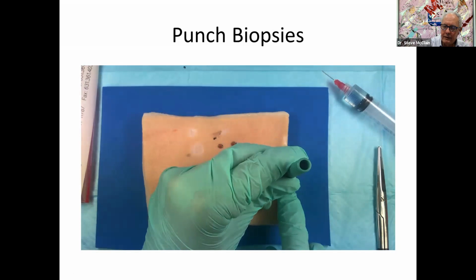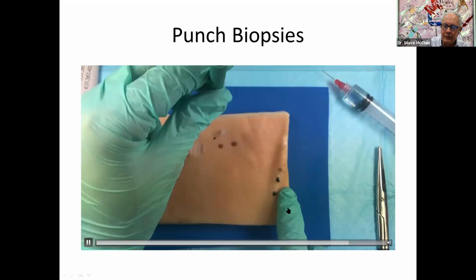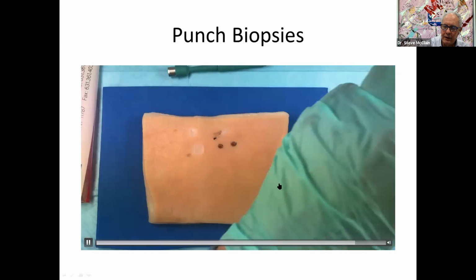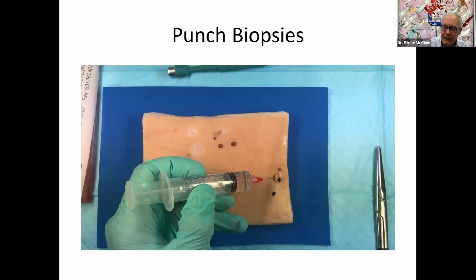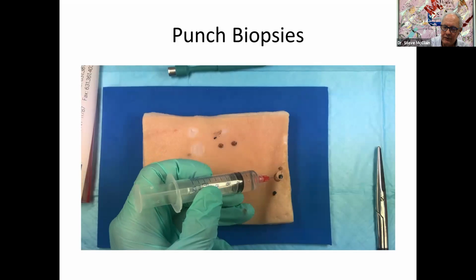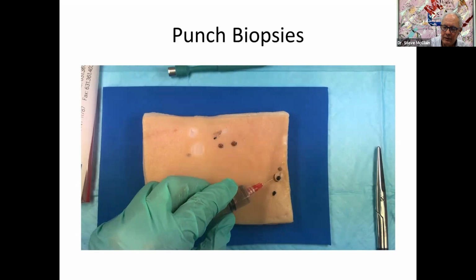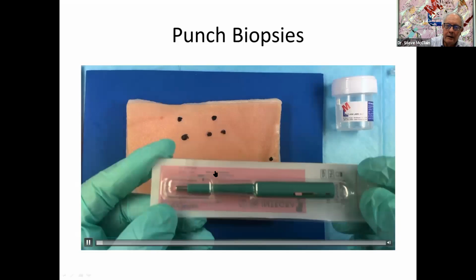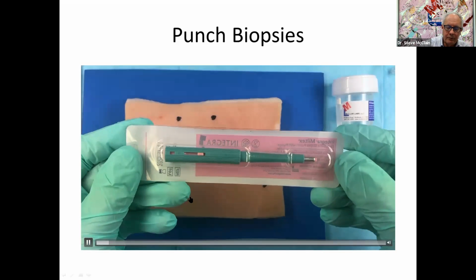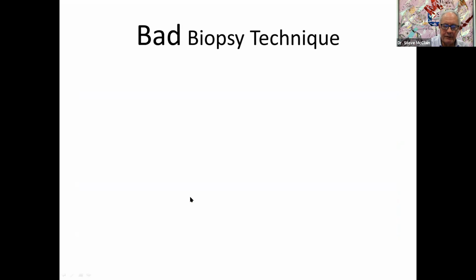Now in this one, you don't want to squeeze it with your forceps. This has been cut off, but you can use your anesthetic needle to gently pick it up. And with a pair of scissors, you'll cut the bottom off. You could use a scalpel the same way. Whoops, what happened here? Okay, I guess he's done. Whoops, we don't need to do that again. Okay, stop.